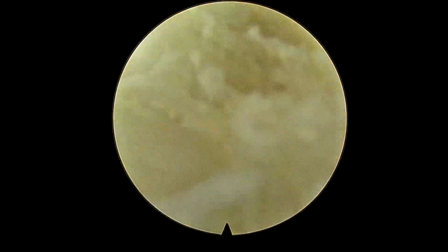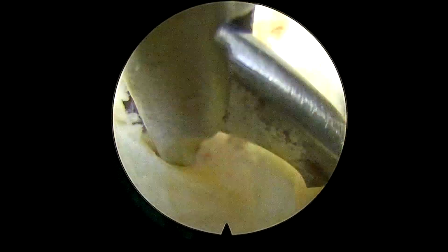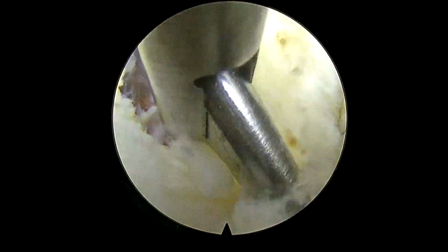So this was the deeper cut. Now you can see we have bridged the epidural space here. We are already in the epidural space. Now you can rotate your sharp instruments with the sharp tip towards the lateral aspect, so that it will avoid any injury to the underlying structure.